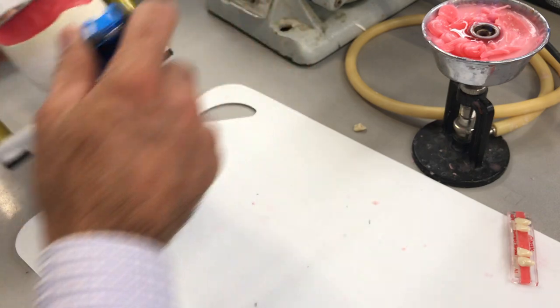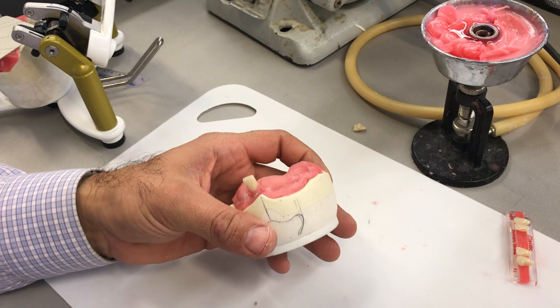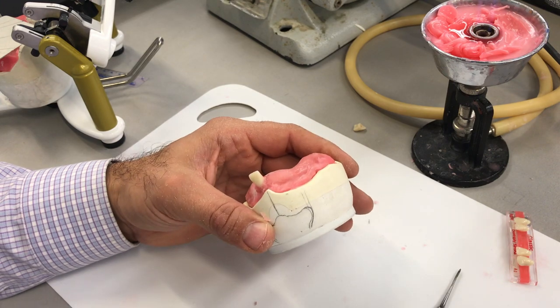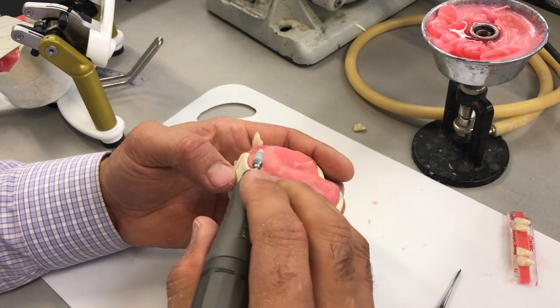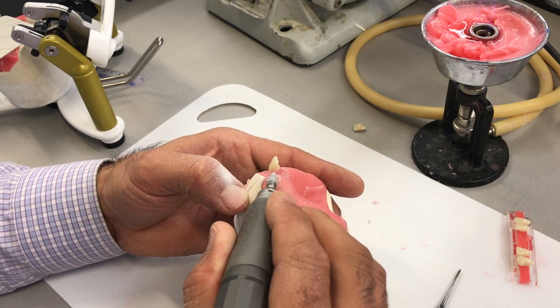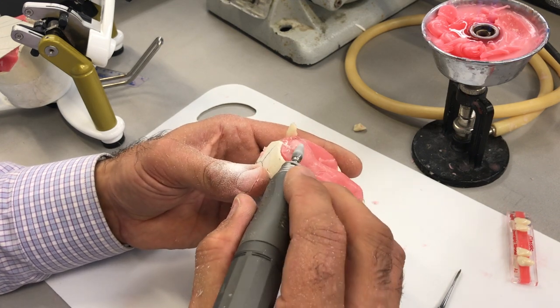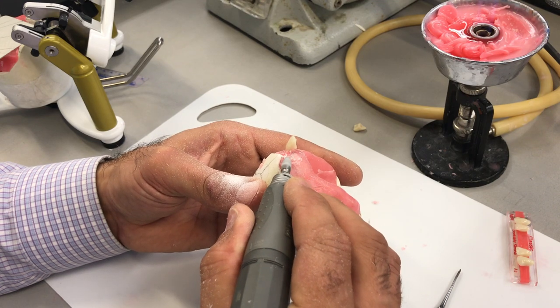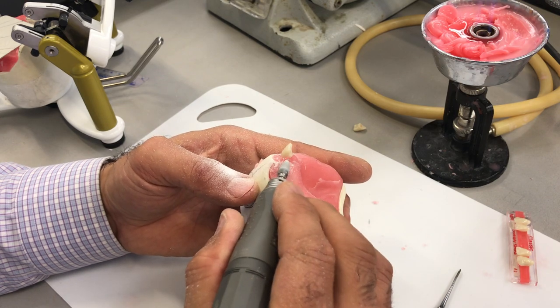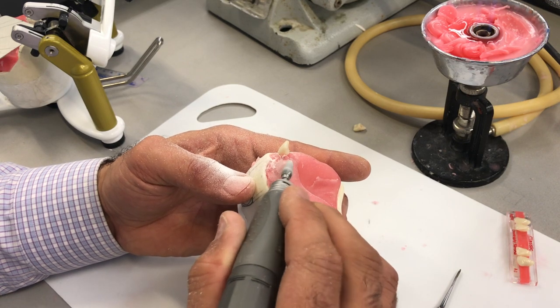I'm going to set that aside and remove this off the articulator, and I'm also going to trim the base plate ever so slightly. I think I have more than enough here without the risk of perforating through the base plate and possibly damaging the cast. If I was really close, I should be taking the base plate off the cast in order to reduce it.